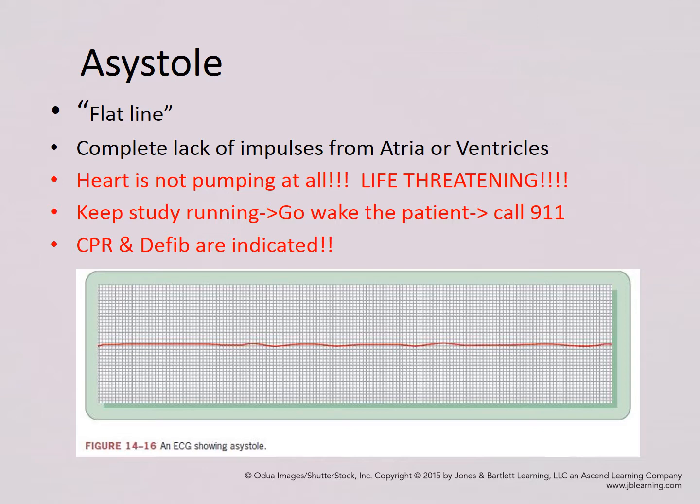The reason we do not call 911 right away is because you could get this line if your EKG lead came off. An important side note to this is if you have this flat line, but you have solid brain activity and breathing, then most likely your EKG tab just came off. So that is why we do not just call 911 as soon as that line goes flat. Let's go on.